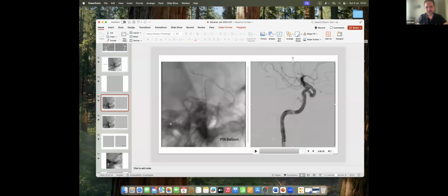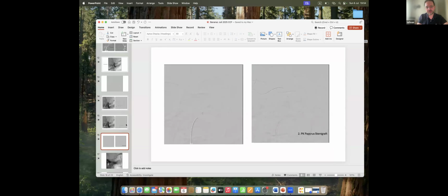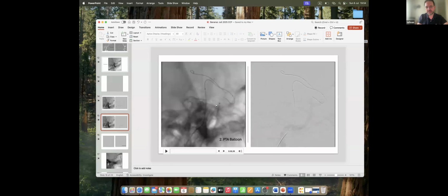I went for the balloon. And when I went with the balloon to make another dilatation, the balloon was higher than the stent, part of it went distal to the stent, and it ran away with the stent distally in the carotid artery and pushed the stent down. So I think I went with the balloon more distal than it should be. That is the reason why.